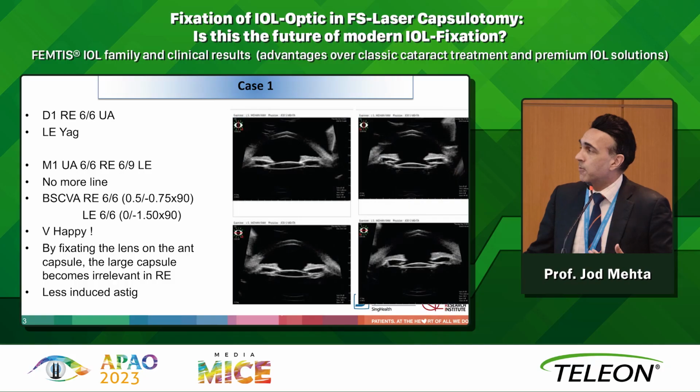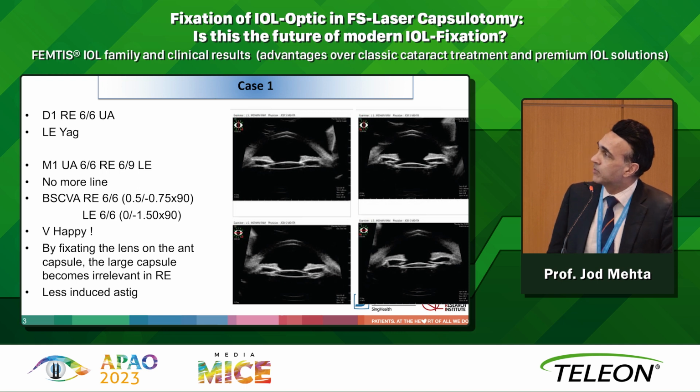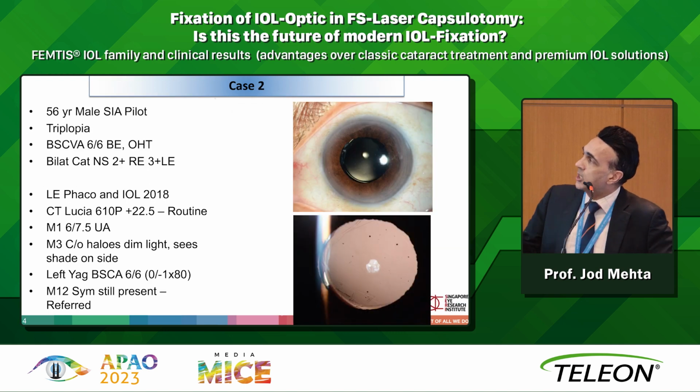And this is related to the size of the bag. I mean, if anyone in this room puts their hands up and tells me they actually measure the bag size, I'll be very impressed. Okay, because most of us don't, to be frank. And because we don't look at it, you just want to look at the density of the lens itself. So we're getting less lens-induced astigmatism as well. Okay, so I'll show you another case.